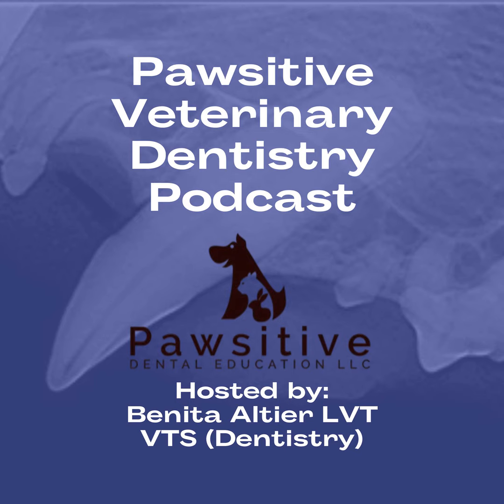So I think the contrast of the image is very important, because sometimes if you have too much contrast and the image is too dark, it can make it appear that there are portions of the tooth, especially right around the neck of the tooth, that are missing and could resemble tooth resorption, especially if you're taking those images in a cat, which it may not be. So contrast, I think, is very important.